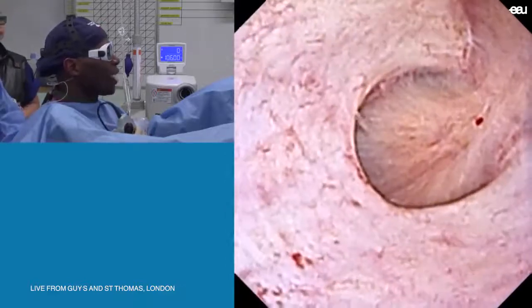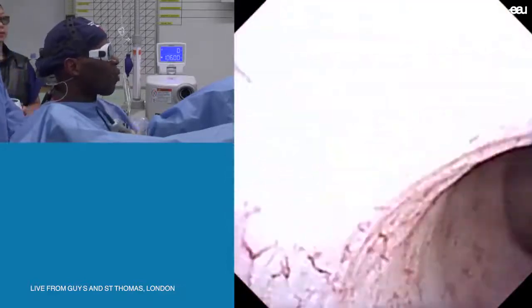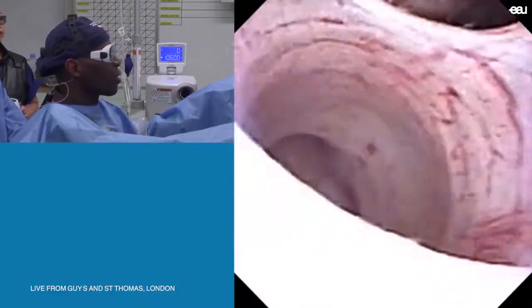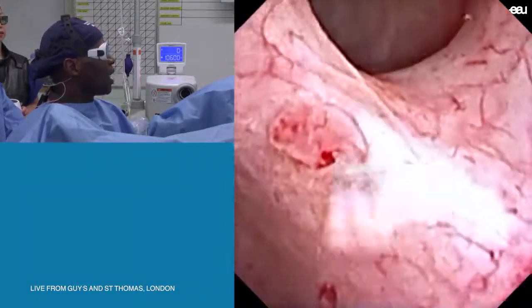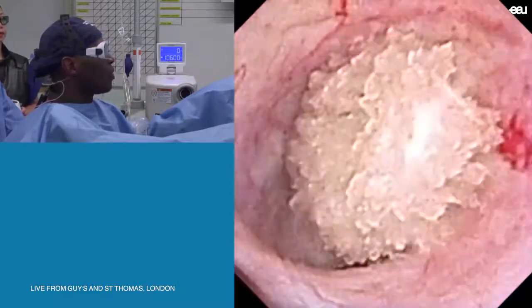I'm in the upper pole of that kidney. Whilst we're waiting for you, we've manipulated the stone. The stone was in the lower pole of the kidney. I've now moved it into the interpolar region.